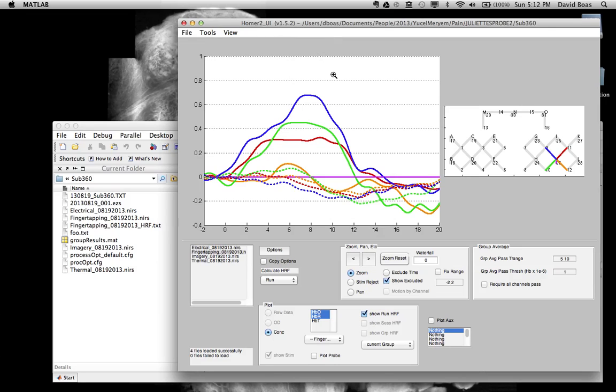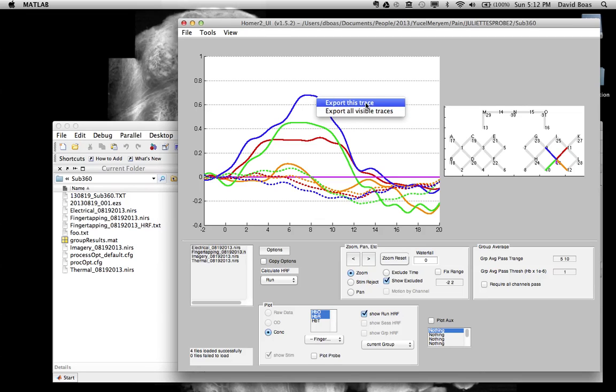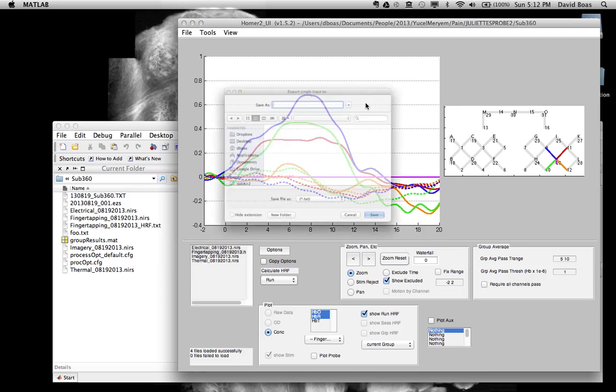And what I want to show you in this tutorial is how to right-click on the plot. So on these traces, you can right-click on any one of these traces. You can say export this trace or export all visible traces. Let's just say export this trace.